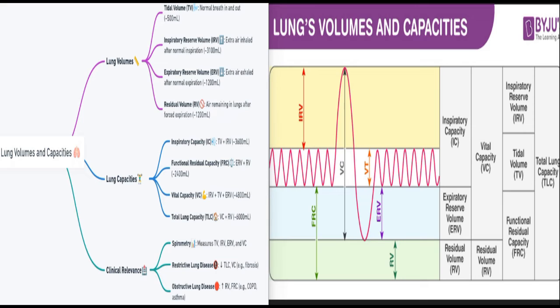So in airway obstruction, you have a low FEV1 FVC ratio, less than the lower limit of normal, and generally the lower limit of normal in average adults is around 0.7, which is 70%, and software is used to predict the lower limit of normal, that's LLN, based on the age, ethnicity, gender, and height.